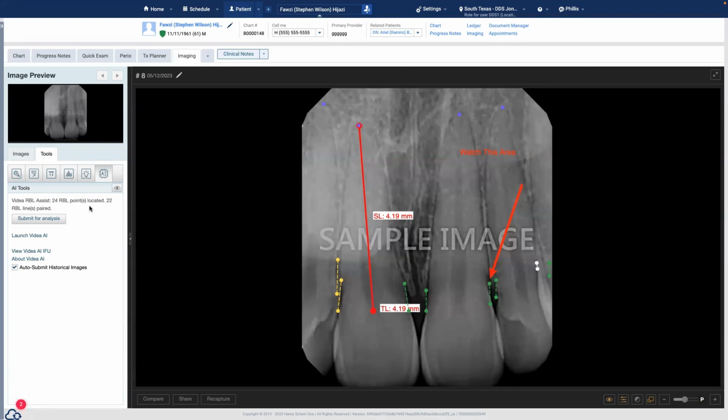Okay. Is there anything else you want to add for this feature? I know this episode of our demo is just about the caries detection and the AI. Is there anything else that we haven't mentioned? I think that covers pretty much everything. What's really important is, if you want some more information, I think your area, Dr. Bob, that you've got on Facebook, ask questions. There are people there who've got the solution and can give you some feedback and information. I think it's really important to get that feedback, and then don't hesitate to reach out to us.